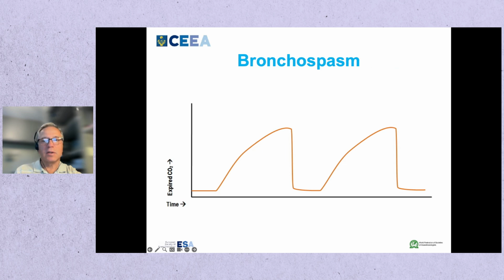This is the classical sawtooth slope of the asthmatic patient. As the airway obstruction in the bronchi worsens, so the slope of the transitional phase becomes more gradual. Note that there is no distinctive alpha angle. This means that the bronchial constriction is so severe that the dead space has not finished emptying by the time the next inspiration comes along. Thus, as bronchospasm is relieved, the alpha angle will again appear.